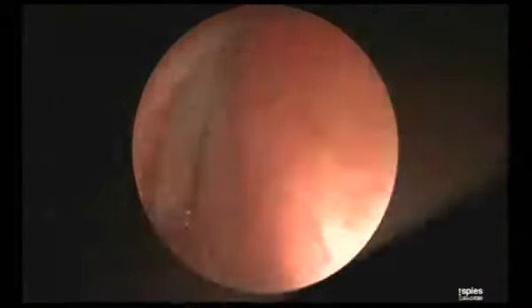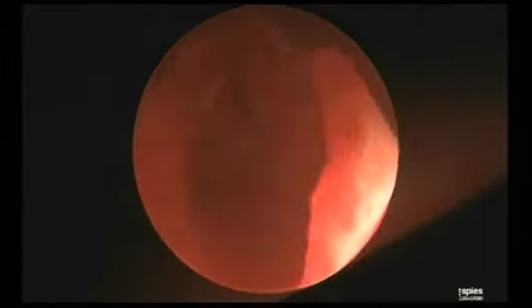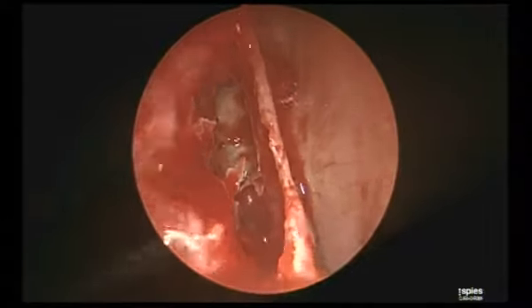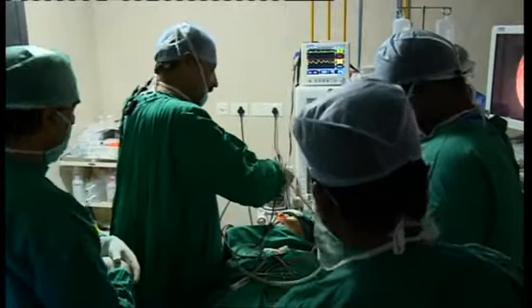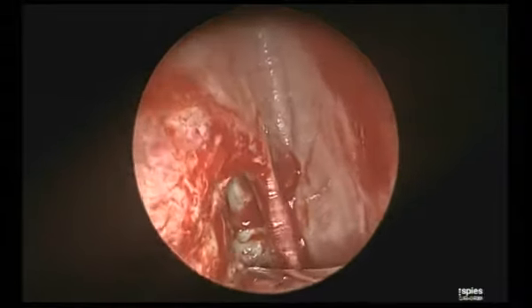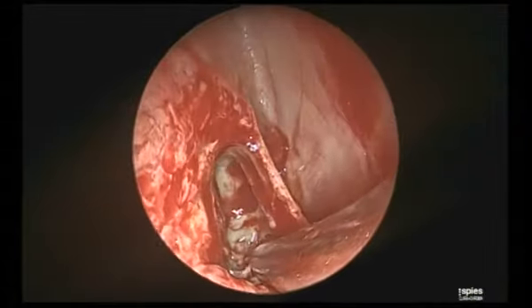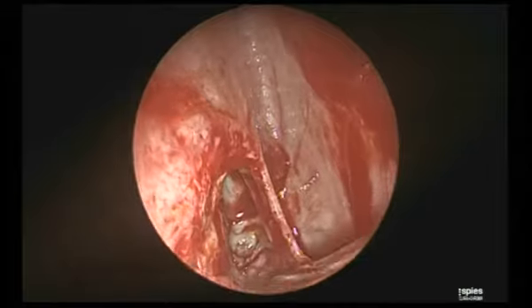See, what simple thing, that is nothing heroic. The same thing what we did on that. This is the upper attachment of the bulla, and just behind that is the artery. Can you see? It is always like that. It's not that I discovered this. God has given us anatomy like that. See now, I will remove this upper part of the bulla a little bit more. See like this. Now you see the artery better. Very nicely seen now.